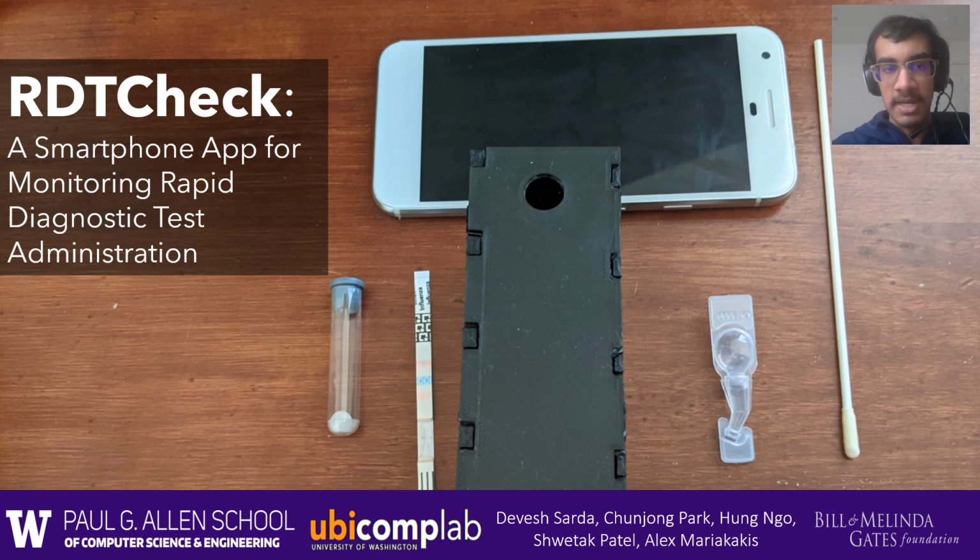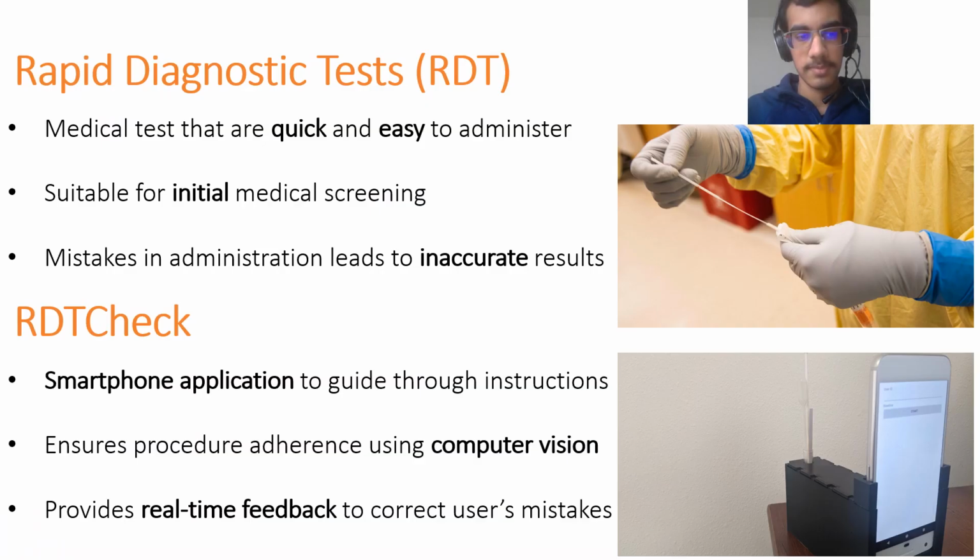In this presentation, I would like to talk about our work on monitoring rapid diagnostic test administration. So, what are rapid diagnostic tests? Rapid diagnostic tests, or RDTs, are medical tests that are quick and easy to administer with a limited amount of resources. Thus, they're especially suited for initial medical screening as well as point-of-care medical testing.